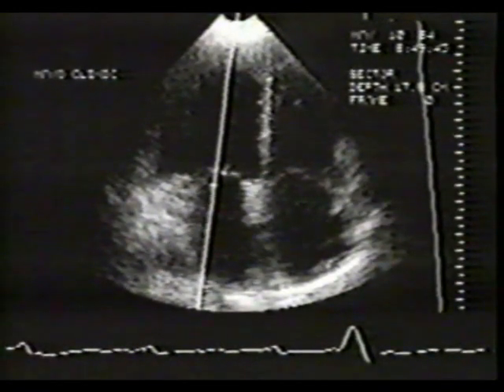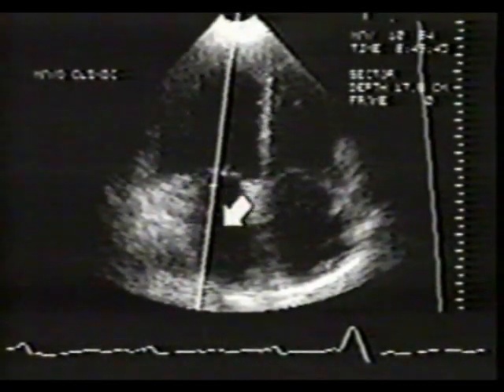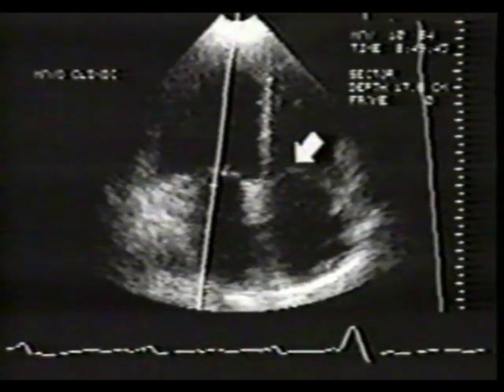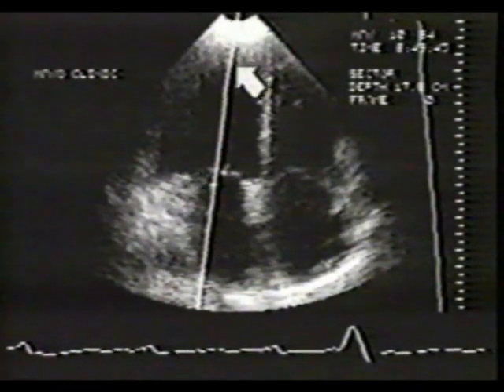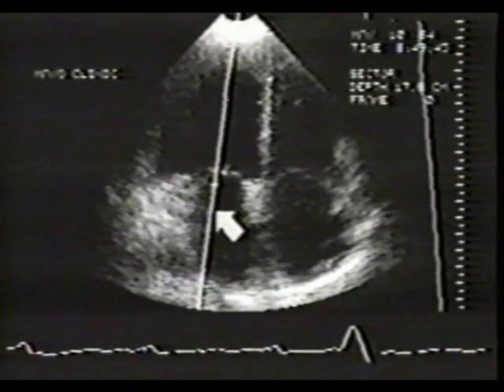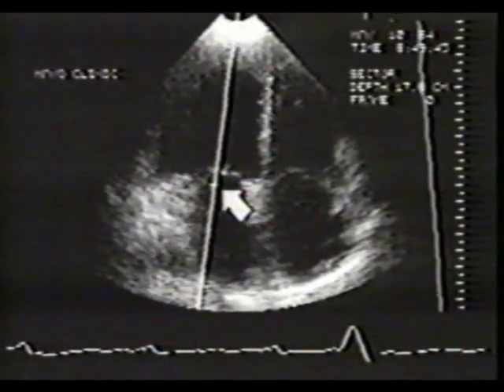This is an apical four-chamber view. Right ventricle, left ventricle, left atrium, right atrium, tricuspid valve, and mitral valve. The Doppler cursor has been placed through the left ventricle and mitral valve and into the left atrium. The sample volume has been positioned in the left atrium, just behind the mitral leaflets.